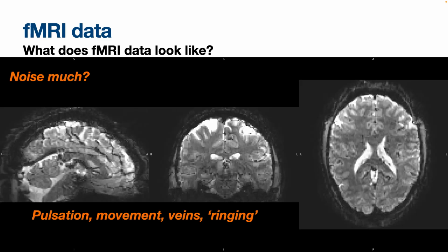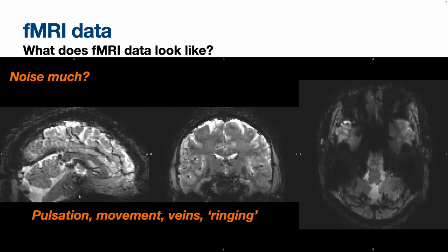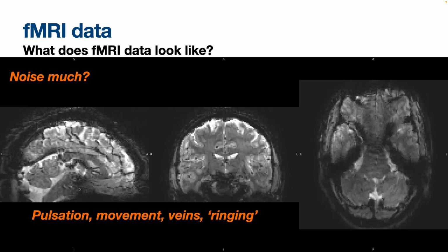Okay, so what does that look like? It looks like this. This is a movie, again, of my brain, and this is a beautiful data set. And it's just a movie. I'm sitting in the scanner. I'm looking at, I don't know what I was looking at. The signals that you get from, for example, viewing a movie, they're so small that you will not see them on a scan like this.